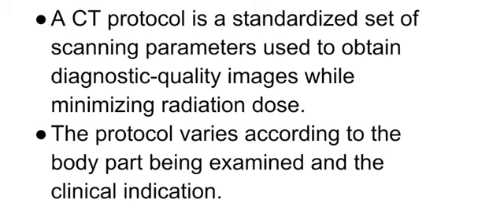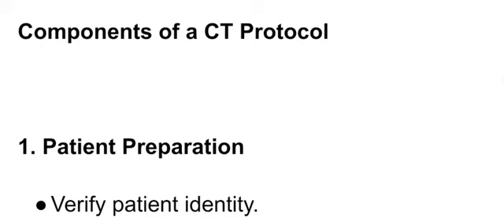First, a CT protocol is a standardized set of scanning parameters which are used to obtain diagnostic quality images while minimizing the radiation dose to the patient. Usually, the protocol varies according to the body part being examined and based on the clinical indications of the patient. Next is about the components of a CT protocol.